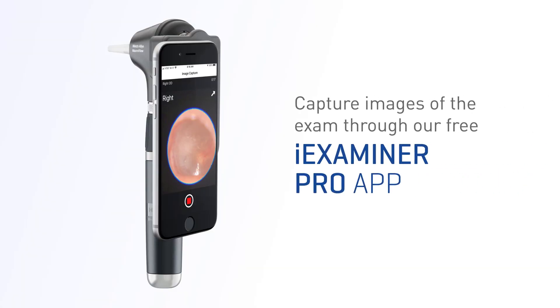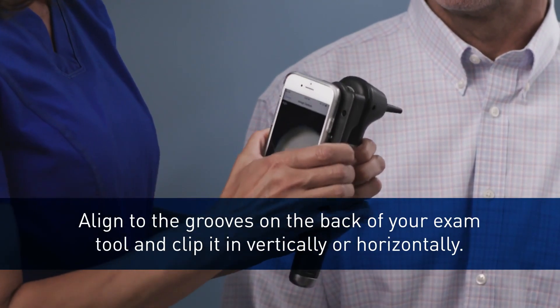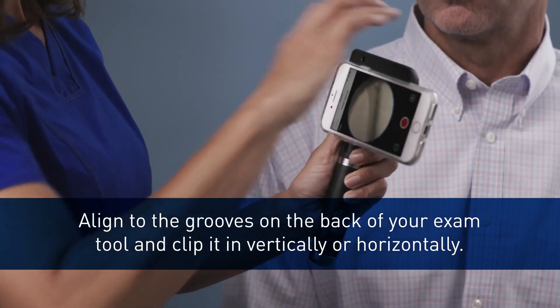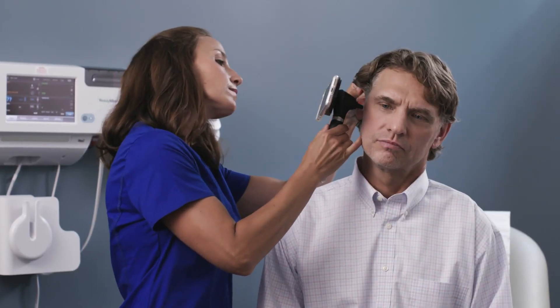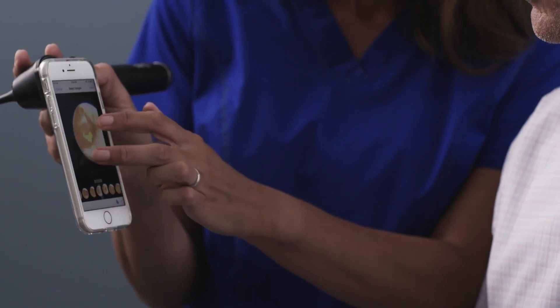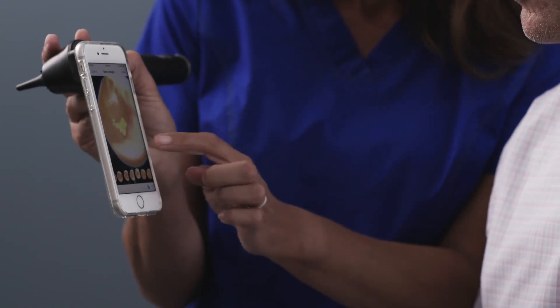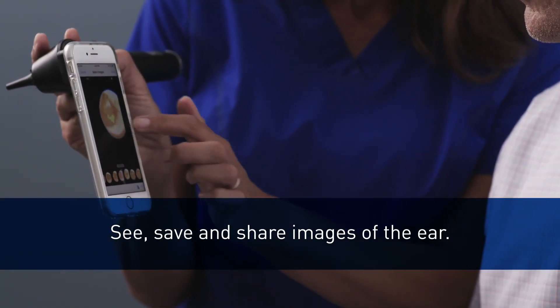You can now capture digital images of the ear exam using our MacroView Plus and our Welsh Allen Eye Examiner Smart Bracket coupled with your smart device. With your smart device attached to the smart bracket, align to the grooves on the back of your exam tool and clip it in vertically or horizontally. Follow the same steps as you would with an optical exam, guiding the otoscope into the patient's ear. Capture moments of the exam and scroll through to find the best images to review and share for consultation and patient education.